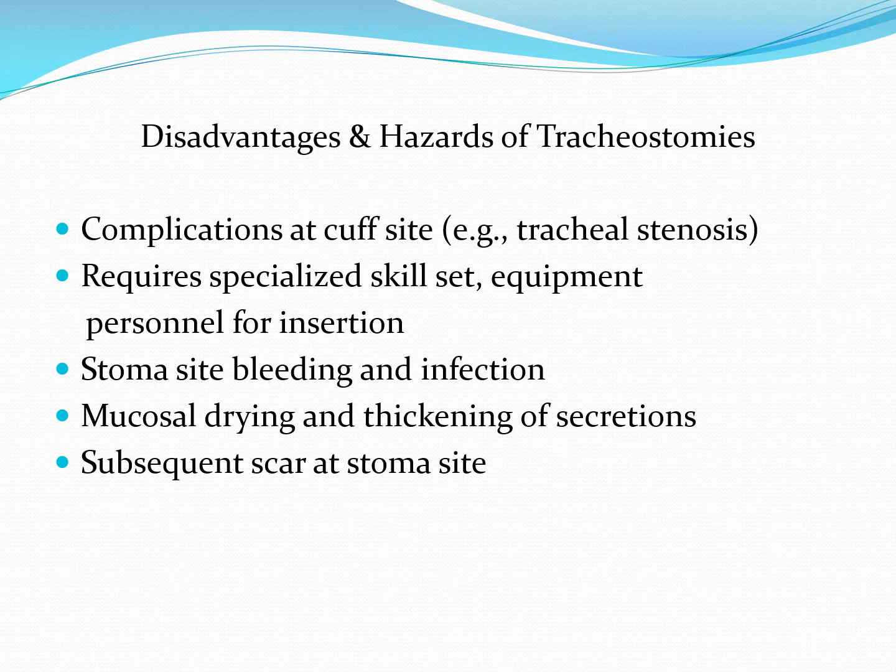In addition, it requires specialized skill set, equipment, and personnel. So it's not something we do casually. It's something, particularly when patients are being converted, if you will, from an endotracheal tube to a tracheostomy tube. It's a process. It requires special skills and equipment. Stoma site bleeding and infection is another concern.